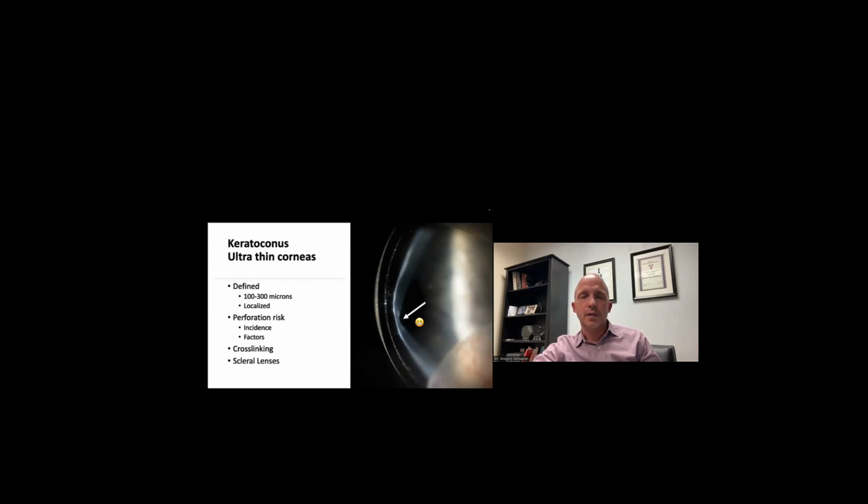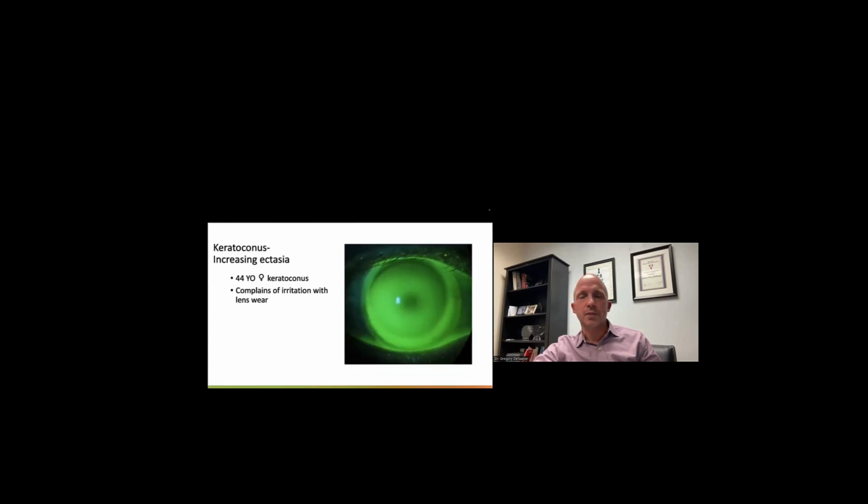So kind of a really great result, and helped that patient tremendously. After you fit patients with keratoconus and we're following them, we have to make sure that we don't see any changes with the fit or the design.